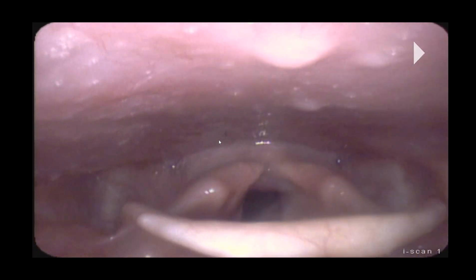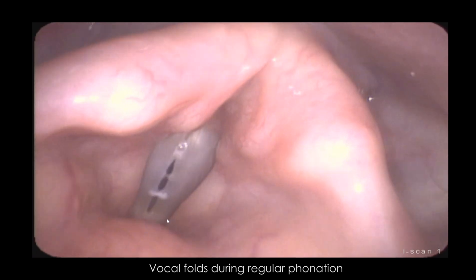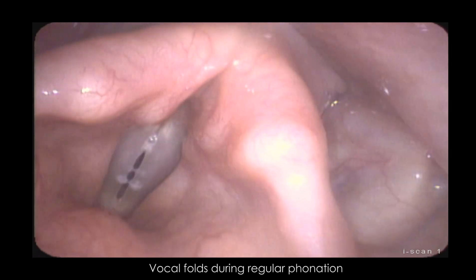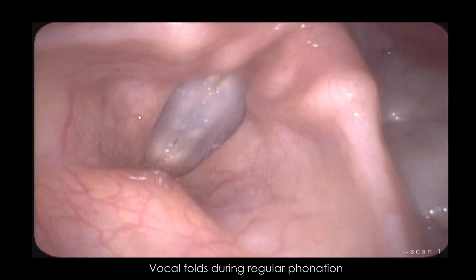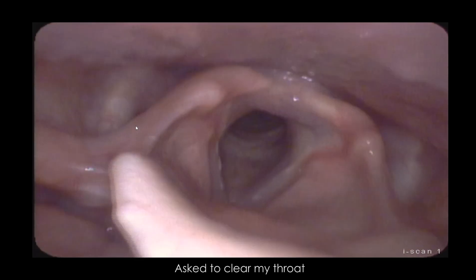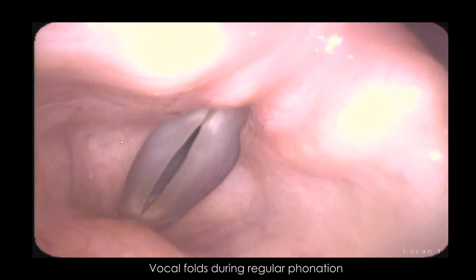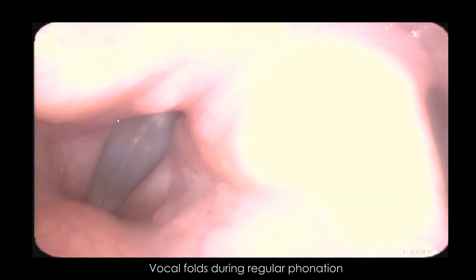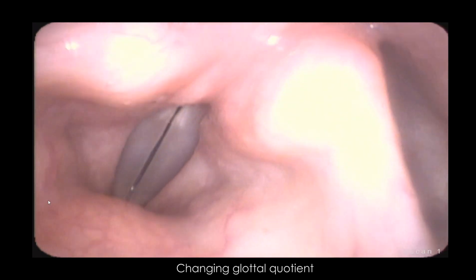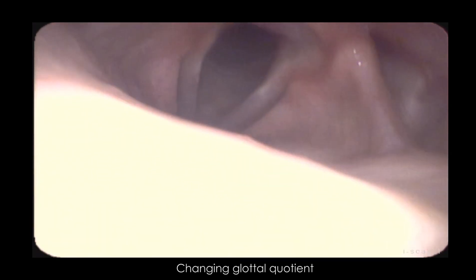This footage is a little bit more interesting — here we look at some vocal function. These right here are the vestibular folds, and here are the true folds. I'm changing my glottal quotient there — let's look at that again.